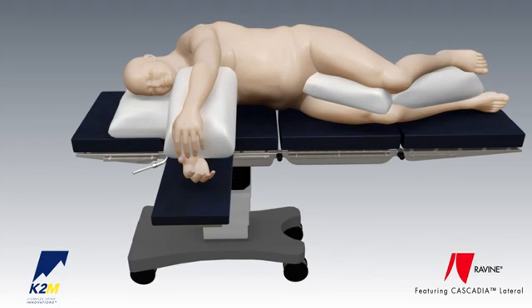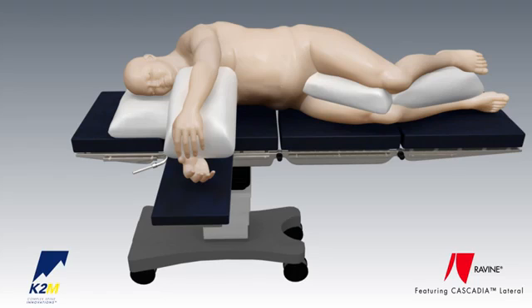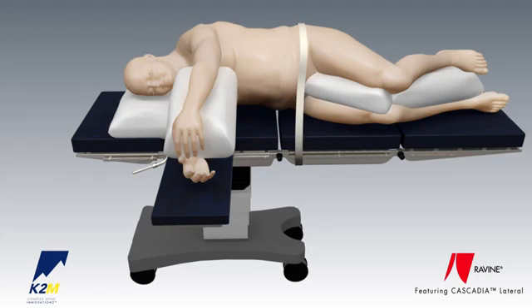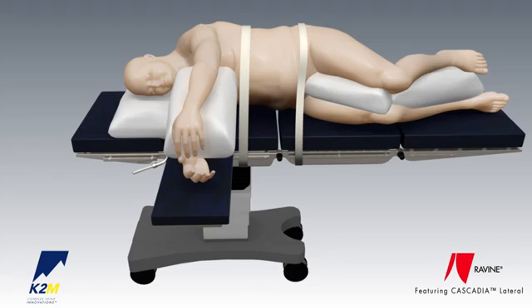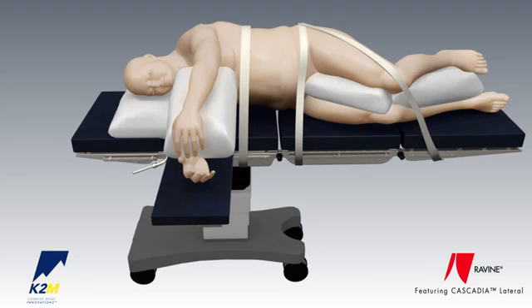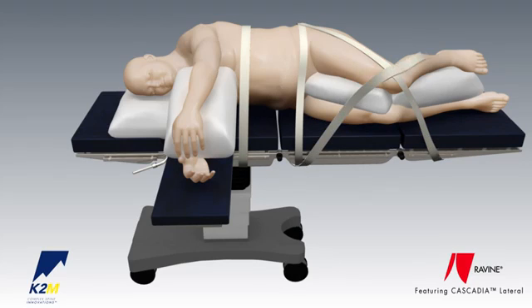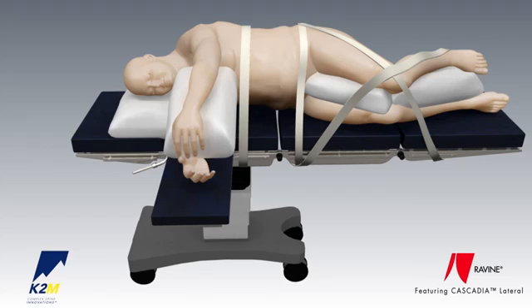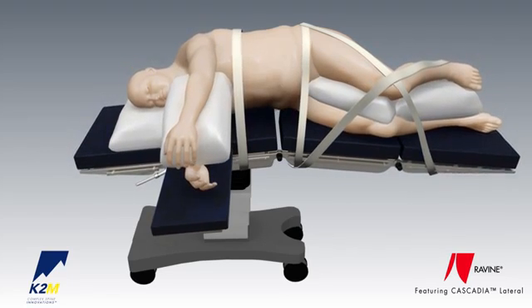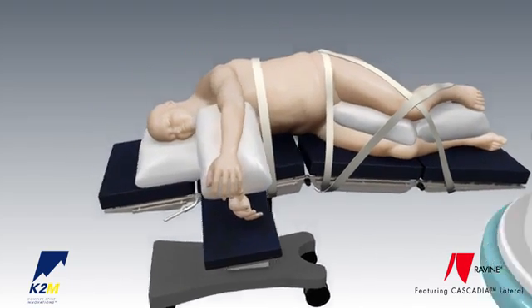Tape is placed on the following regions to secure positioning: just below the iliac crest, over the thoracic region, from the iliac crest across the knee to the table, from the table to the knee, and over the ankle and to the table. Care should be taken to prevent any undue pressure points.